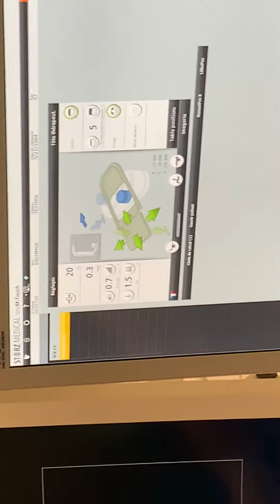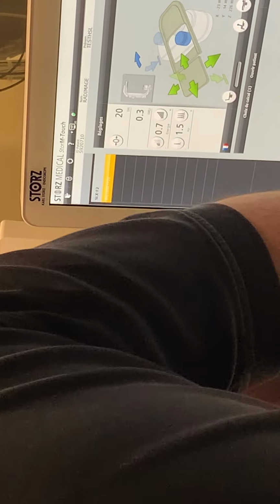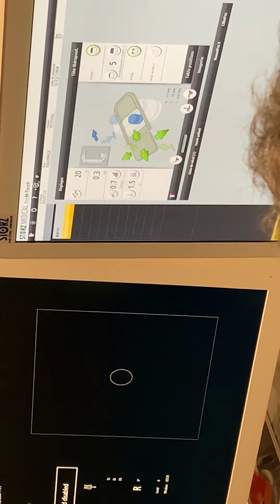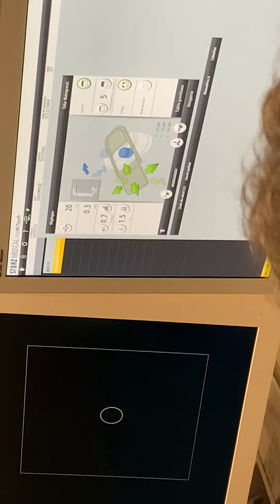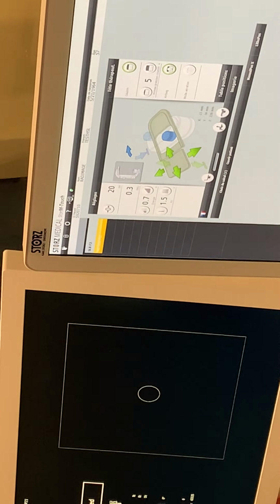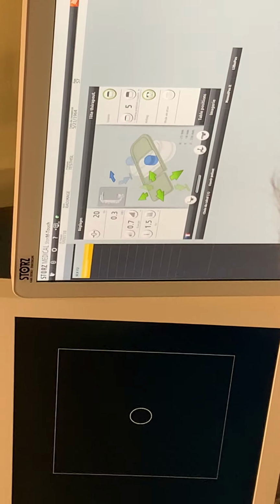Here, see? This white line was not there before. The collimator collimated automatically. No problem, it's fine. We used to press on the airbag if we wanted the airbag. So now it's off. Now we are not releasing shockwave. While you are not releasing shockwave, the airbag is on. Okay. Now you are starting with the treatment.